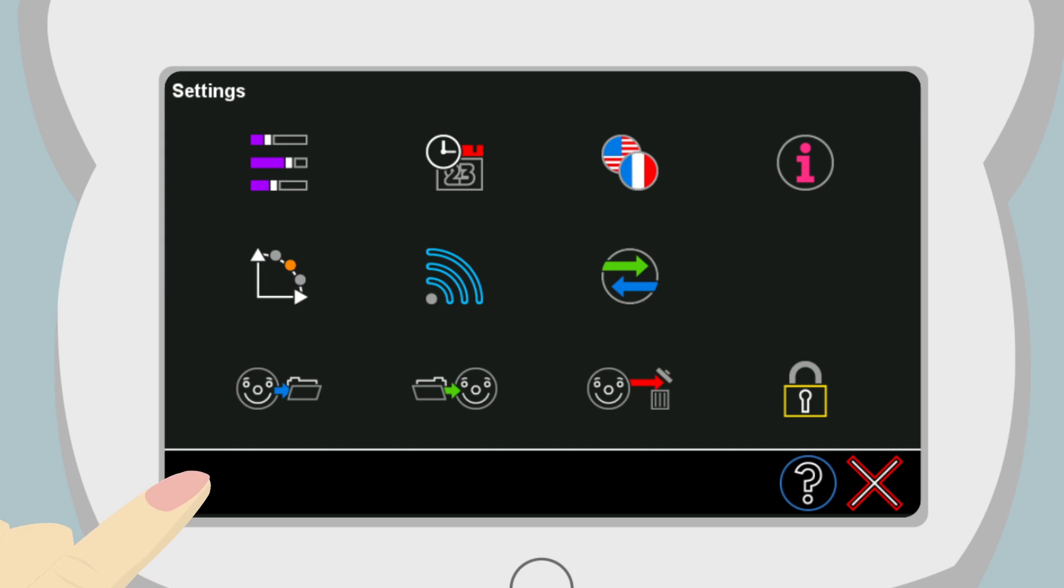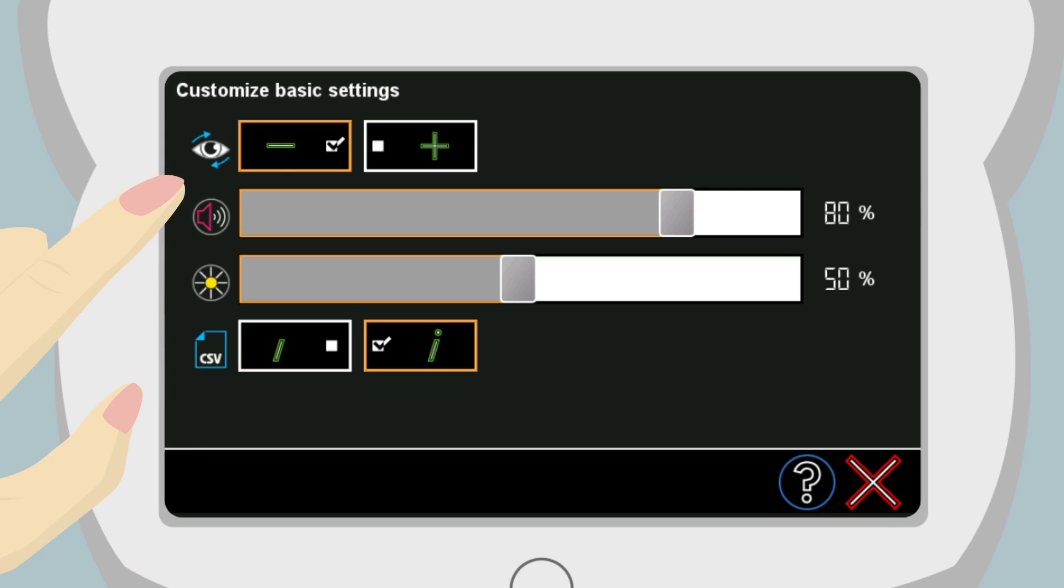Now touch the Settings button and then the button for the basic settings on the top left. This is used to adjust the device operating settings.